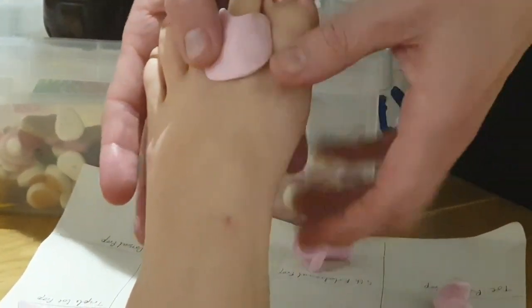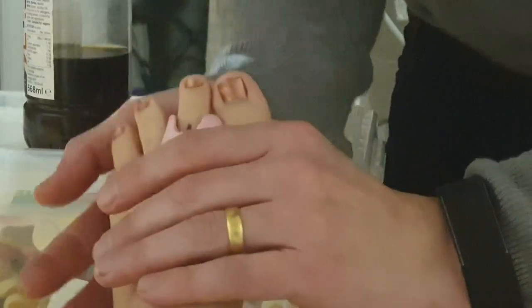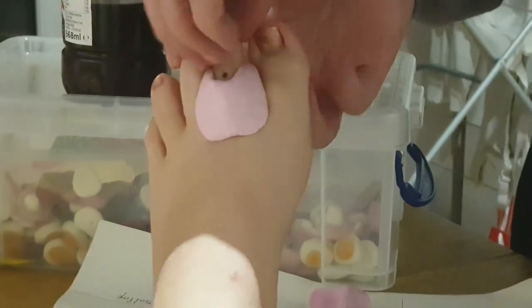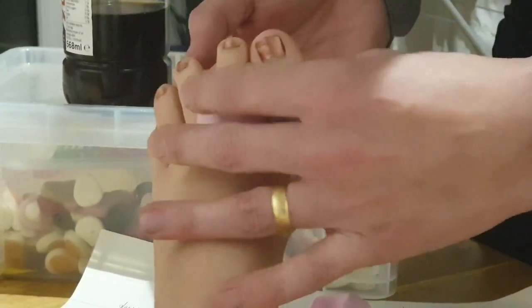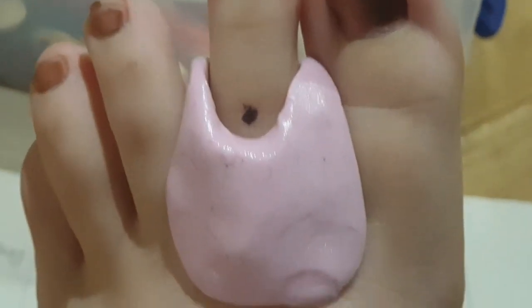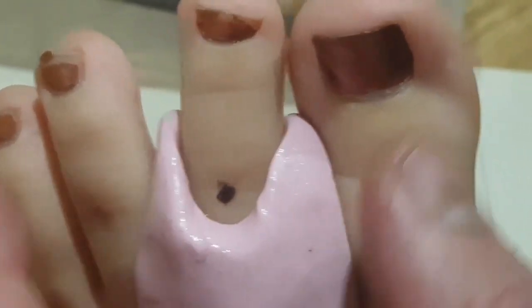We're looking for a sort of hump here. You've got a fairly thick cutout so when the shoe presses down on it, the shoe presses down on there and that keeps it off of the toe. You want those bits between to be reasonably thin — they only need to be there to hold it in place, tiny little lugs underneath.